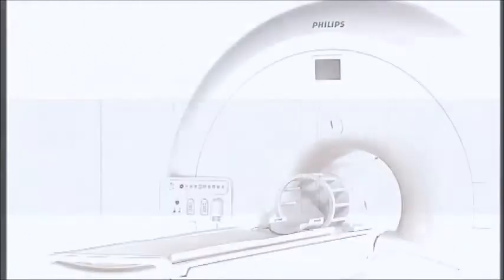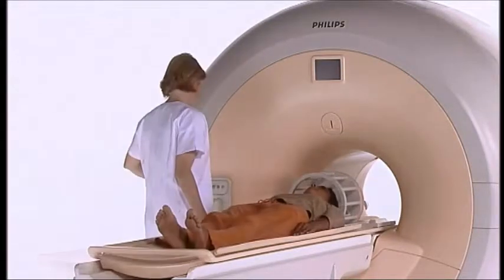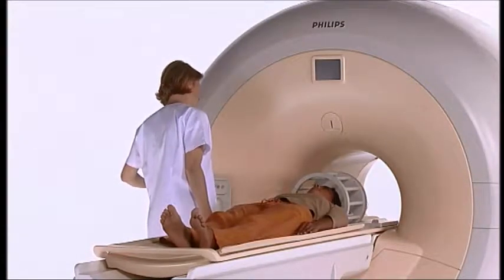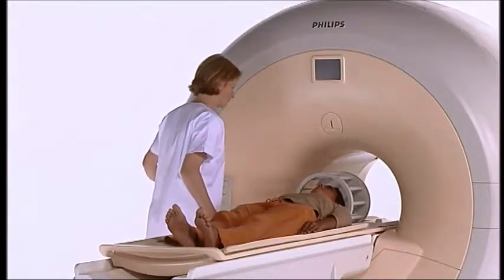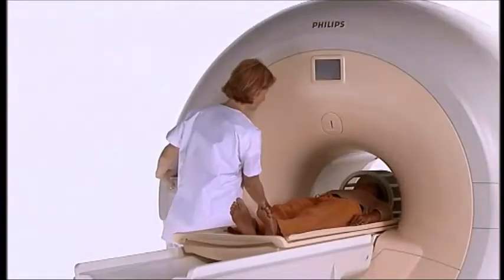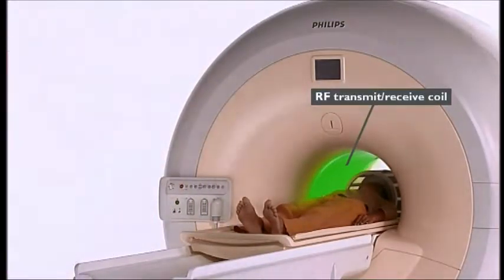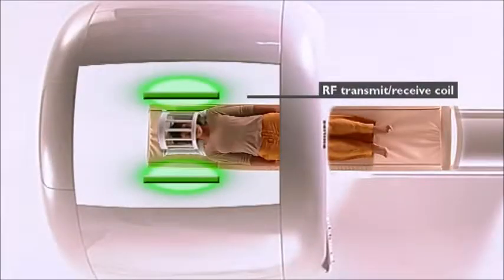RF introduction. To be able to image protons in a large volume, it is important for the applied RF energy to be homogeneous over the whole region of interest. For this reason, a large RF transmit and receive coil, the RF body coil, is built into the scanner. The region of interest is placed in the center of the RF body coil.